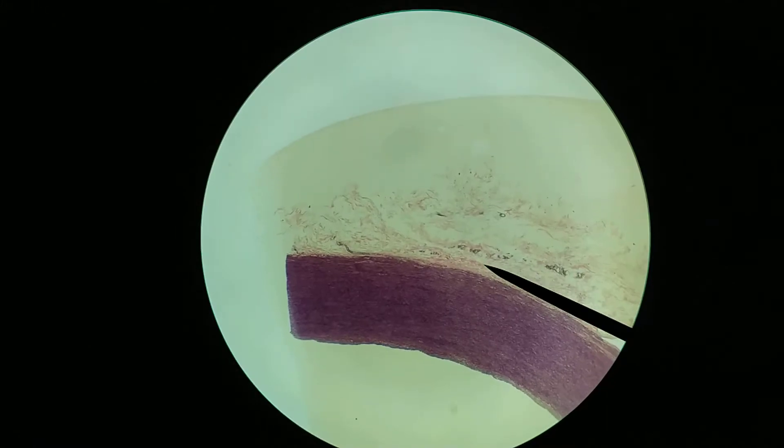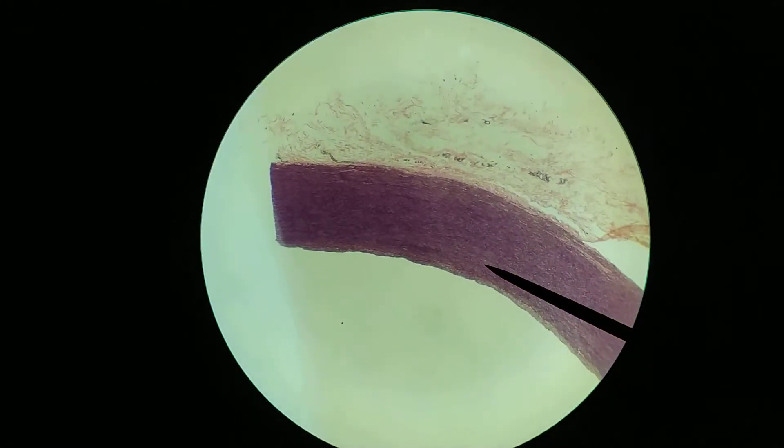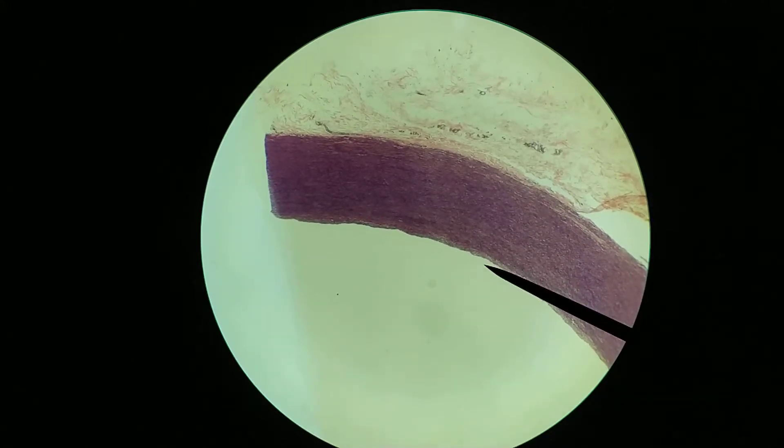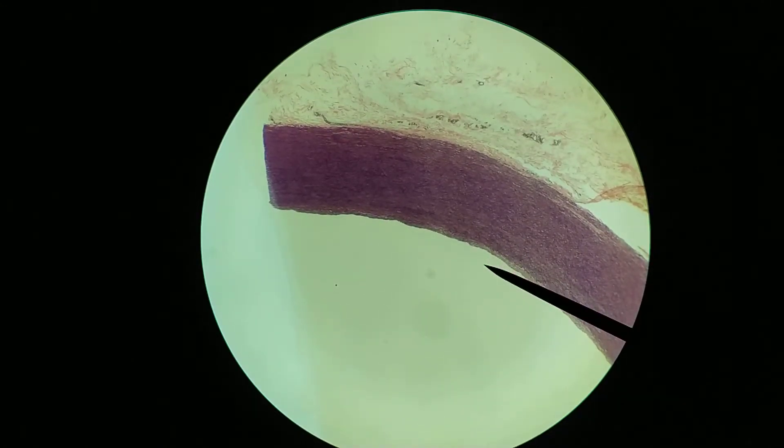So again, tunica adventitia out here, tunica media, and then the tunica intima is the innermost layer here. So we've looked at this and got the overall organization at low magnification. This is 100x.